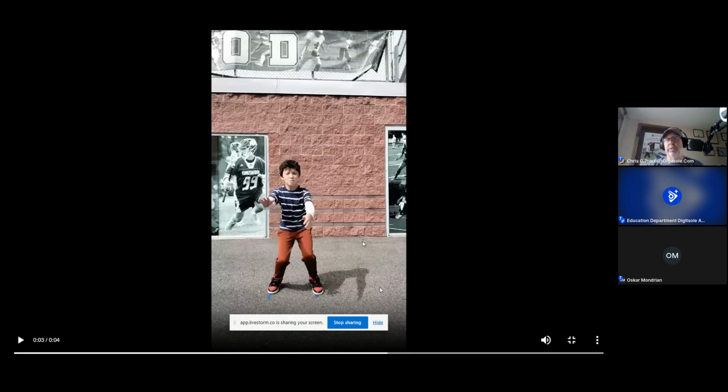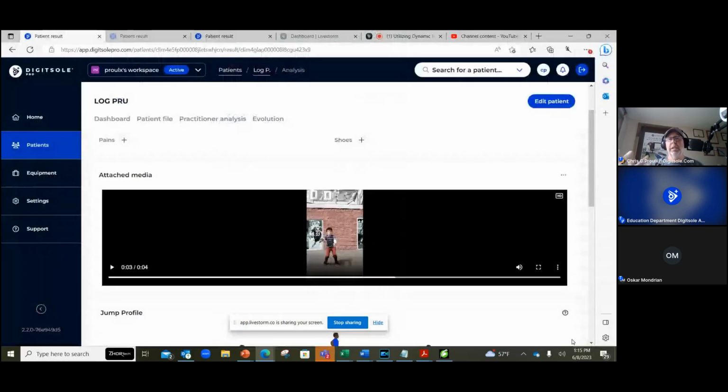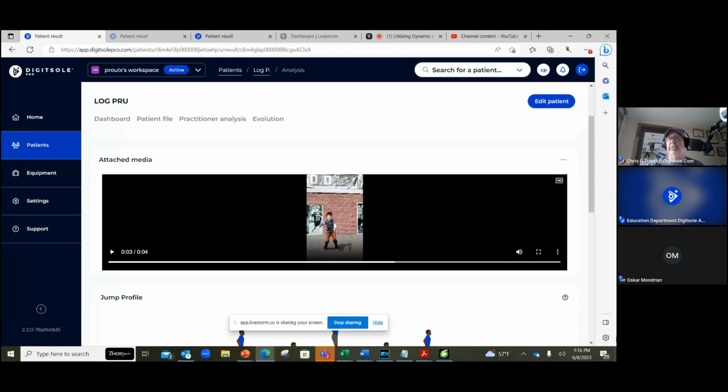There are also certain limitations in the frame rate, or the speed, the number of frames, right? Most cameras will shoot at a frame rate of about 30 frames per second, and that seems like a lot, and it's more than enough for basic collection of video. But when we think of things that take a fraction of a second and even smaller, like when we're looking at peak force development, that actually take place over a really short period of time, you might want something a little bit faster if you wanted to get into that. So that's where the video is going to populate with your system.